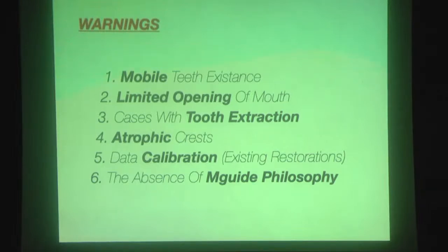And when you first look at the patient, if he or she cannot open his mouth more than 2 fingers or 2.5 fingers, then no way. Please don't use the guided surgery.